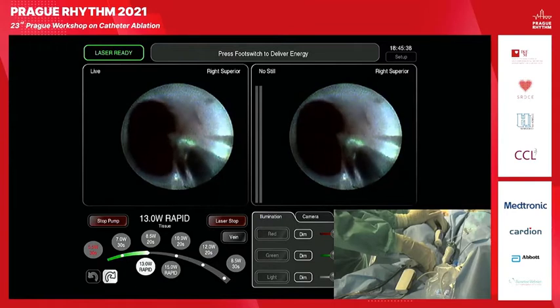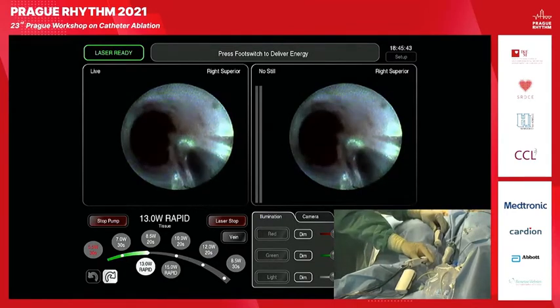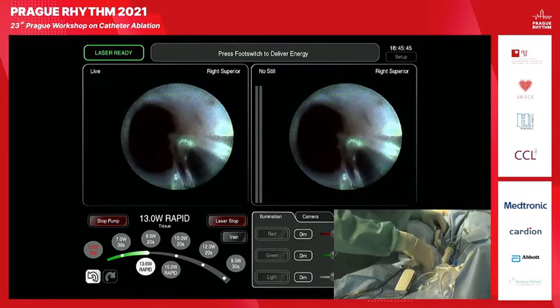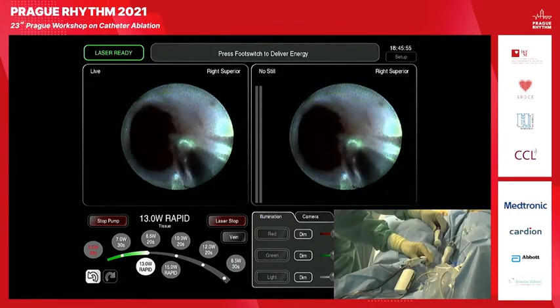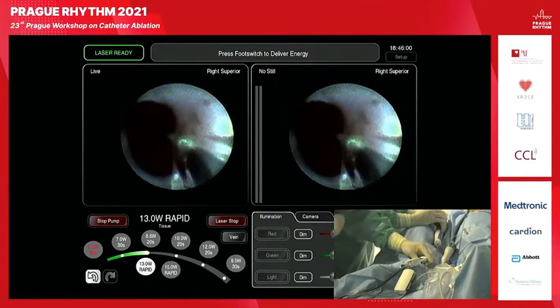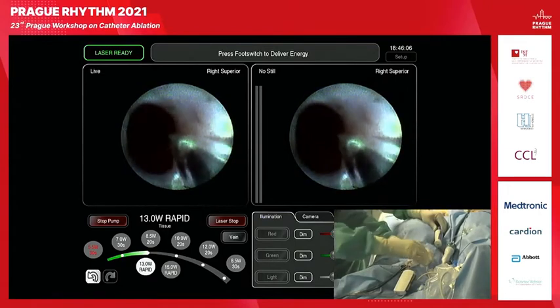So, what do you want to go, counterclockwise or clockwise? I will go counterclockwise. Okay, so we will start here. No, we will start here and go counterclockwise. You have two options: clockwise, counterclockwise. And in any single minute, you can stop and switch to the manual mode, which is sometimes better because you can apply less energy if you have poor contact with the tissue.